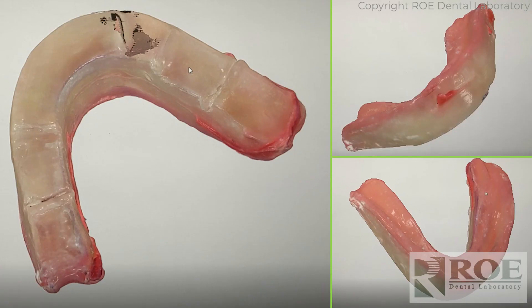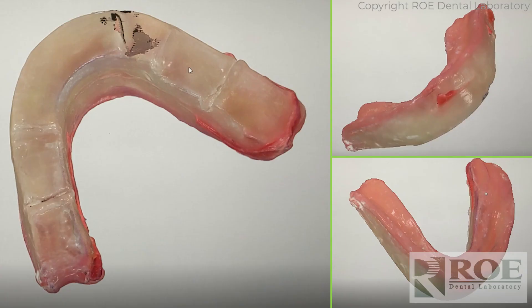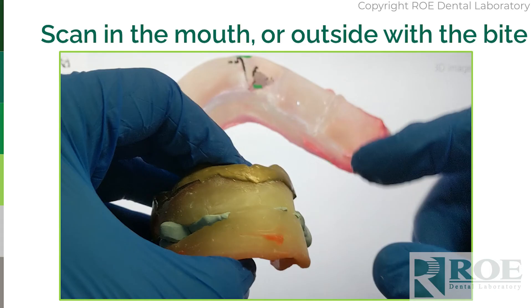On the mandible, it's the same process: scan the intaglio, roll around to the borders, roll around to the facial, and then to the occlusion. In this demonstration we scanned everything — we have the latest Trios here at the laboratory — but if your scanner will not do it, the part to skip is the lingual or the palatal. This is all outside the mouth. If you've captured a bite registration, simply scan outside the mouth and hold it in your fingers to scan.